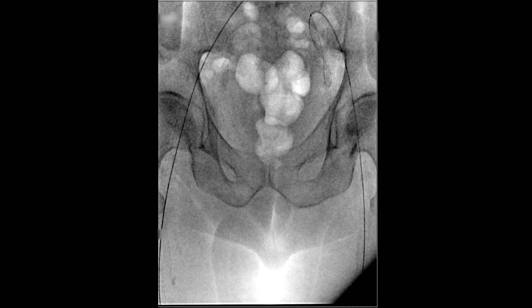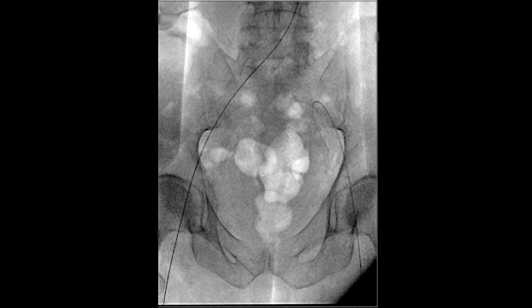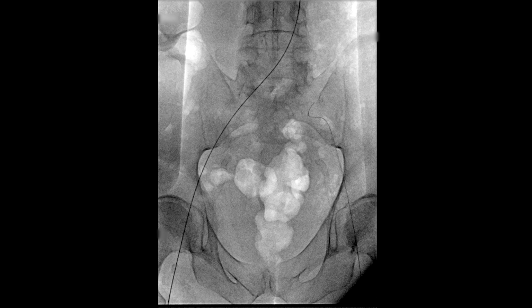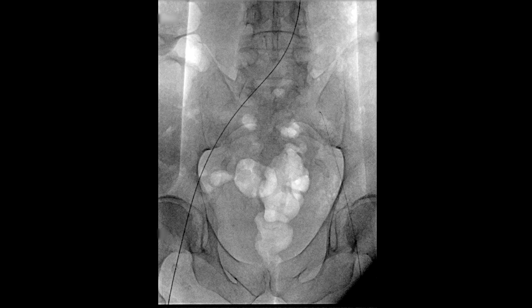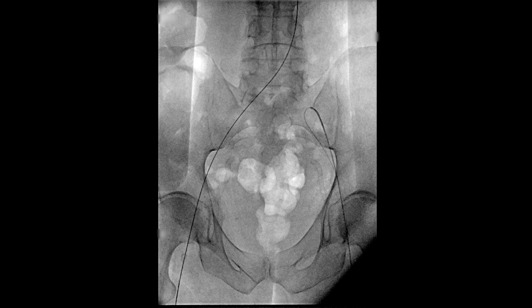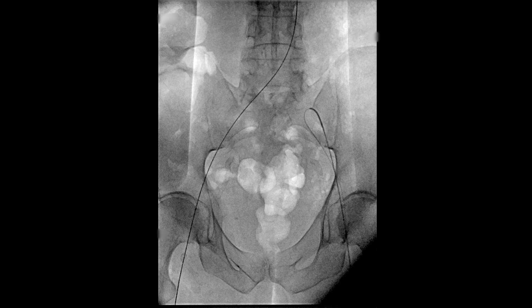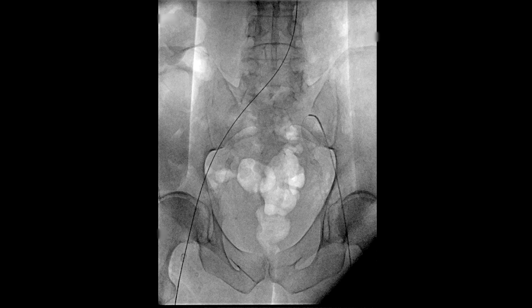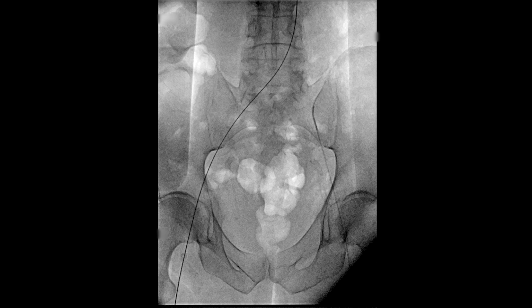We then turn our attention to the patient's right lower extremity. You can see our Advantage wire now trying to seek and find its path up to the inferior vena cava. It buckles, likely from chronic thrombus, in the patient's right common iliac vein. A Berenstein catheter is then introduced, and then we try and cross the thrombus with the combination of our Advantage wire and our Berenstein catheter.